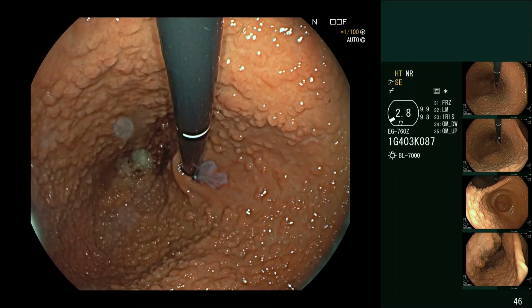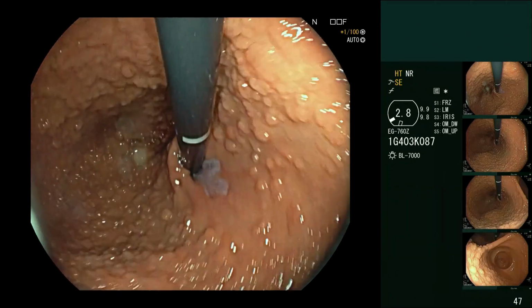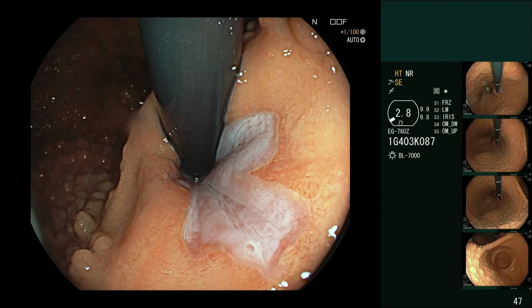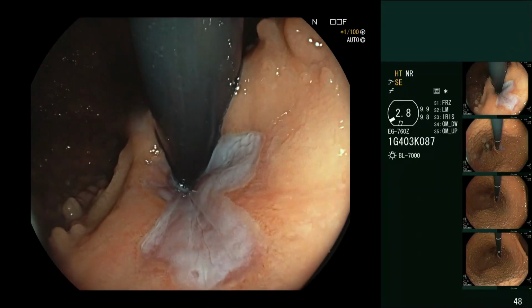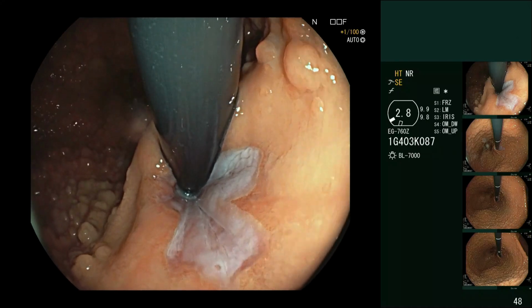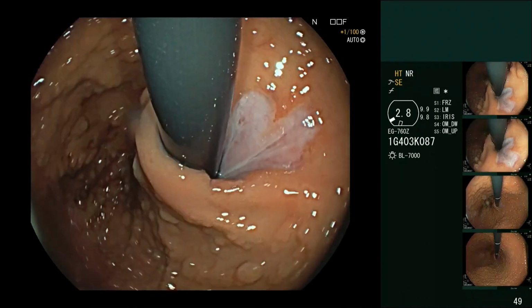So how do we do that? Well, we take standardized photography, so an overview shot, and the shot up in the gastroesophageal junction, with always a reference point in, right? So you can clearly see the lower esophageal sphincter, and you can see the position of the greater and lesser curve. So in this case, you can clearly orientate the image.